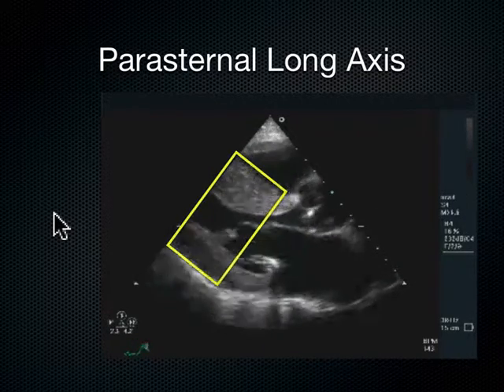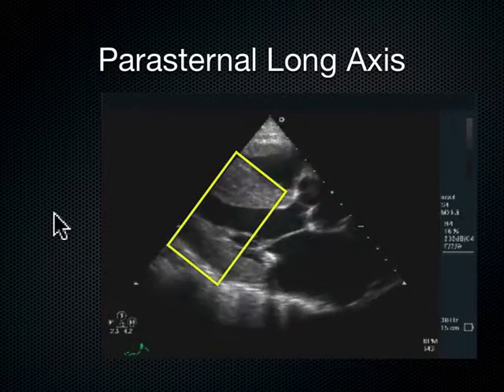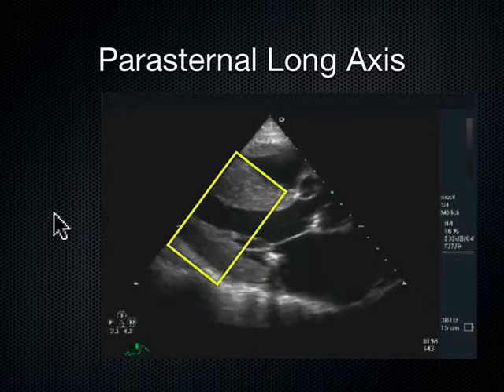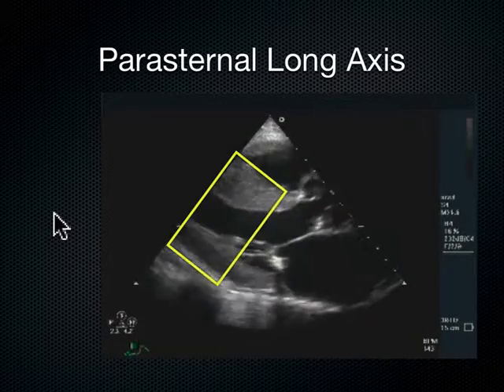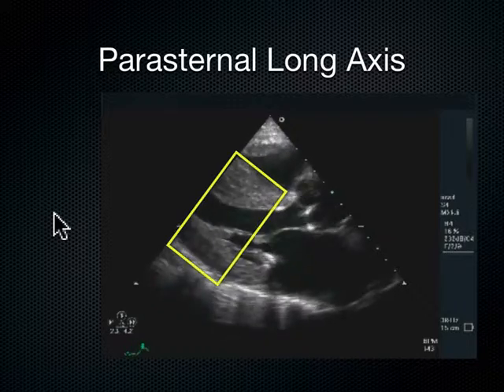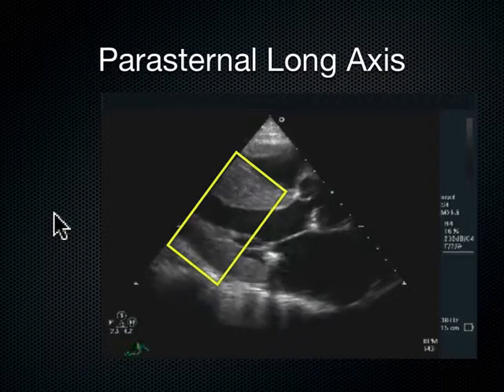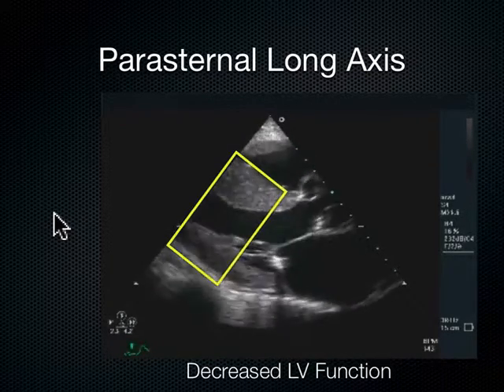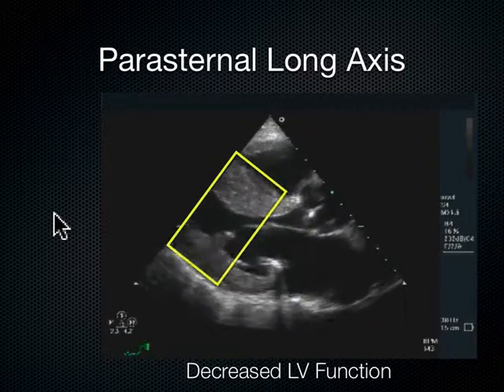That posterior wall and septum are not really moving much at all. And the tip-off is that the septum is extremely thick. This is a patient with cardiomyopathy. Whenever you can see the heart that beautifully, I'm always a little suspicious, because big cardiomyopathic hearts are beautiful on ultrasound. So if this patient was hypotensive in my ED, I would really consider inotropic therapy, as opposed to the last patient who had normal LV function — if their blood pressure was 70 or 80, I would really be considering fluids.